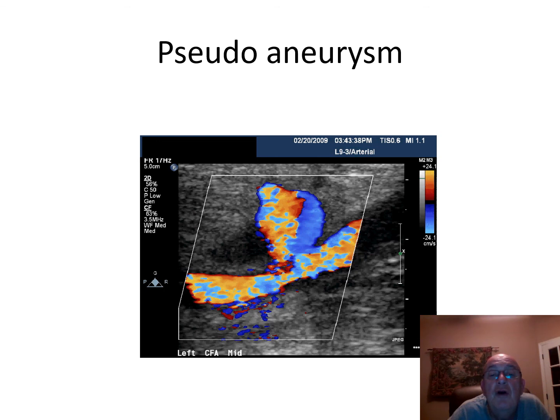If the neck's too large, it leaves the possibility of having thrombin get into the artery itself, which would then thrombose the entire artery, which is not how you want to have your day go. In that condition, it would require intracatheter thrombolytics for quite some time to undo your mess. And of course, if the neck is really large and they don't want to do the thrombin, they can just go in surgically and tie a little knot around there and just tie it off.